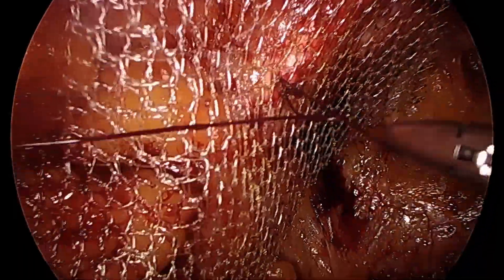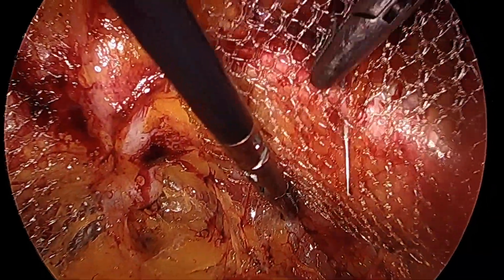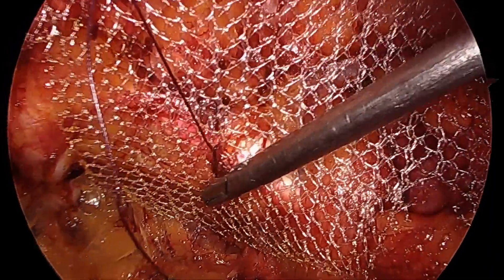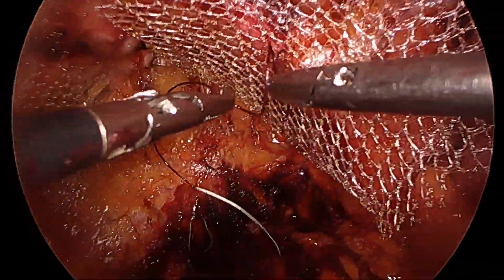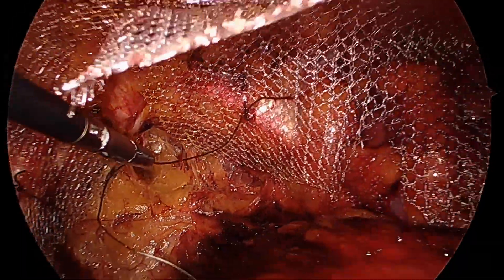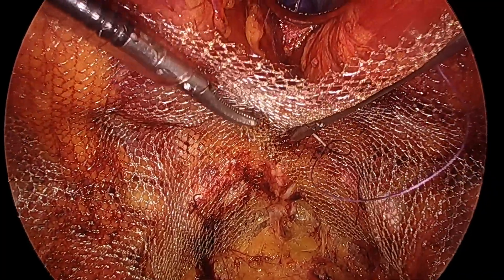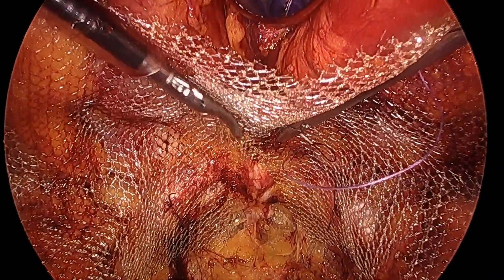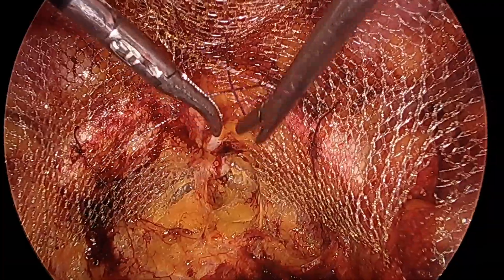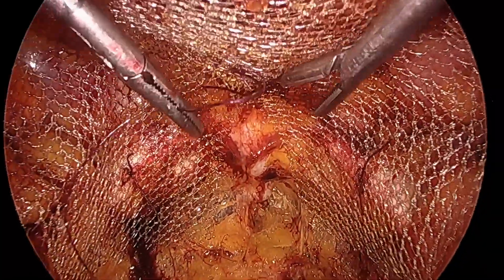Because we don't want to injure the midline with trocars after having closed it, I prefer to do the dissection in the ventral area first, then the dissection for the inguinal area, mesh placement, and then go back to close the ventral hernias. Here we have a very nice overlap of the meshes — they look quite symmetrical, both reinforcing adequately the myopectineal orifice on both sides.